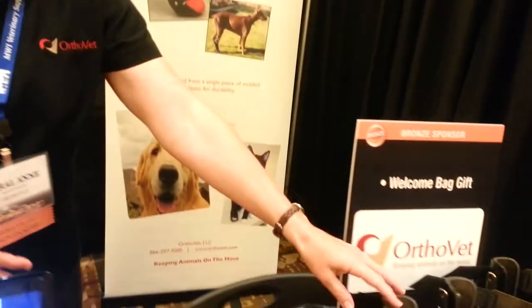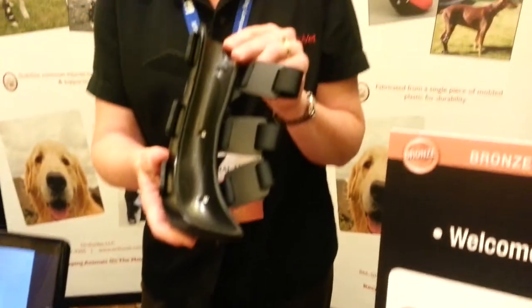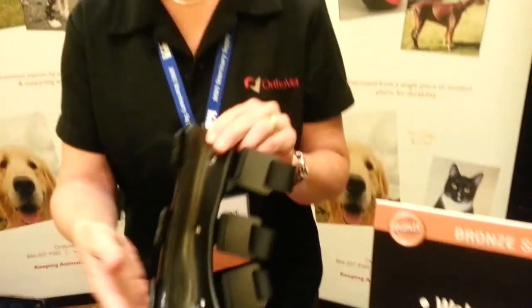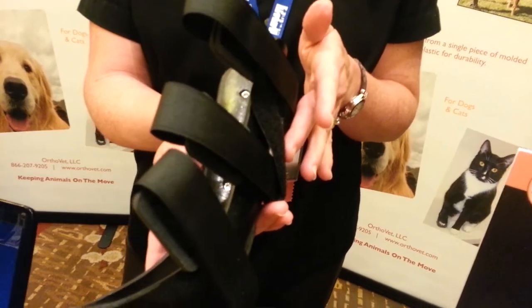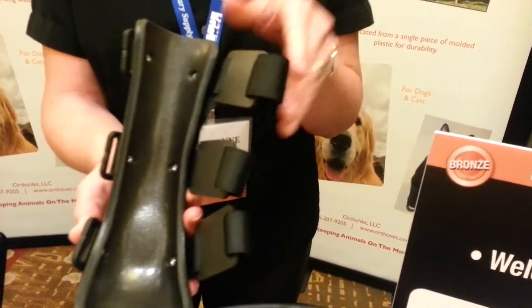We also have our front limb splints available, coming in sizes extra large on down through the smallest size or feline size. Same strapping system as our rear limb splints. These are a rigid splint with a soft foam lining on the inside.